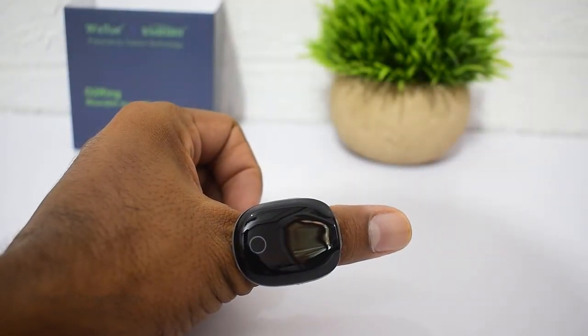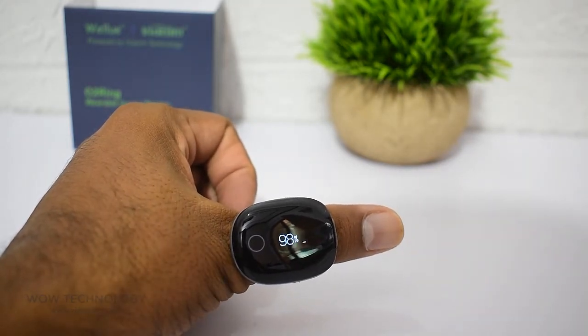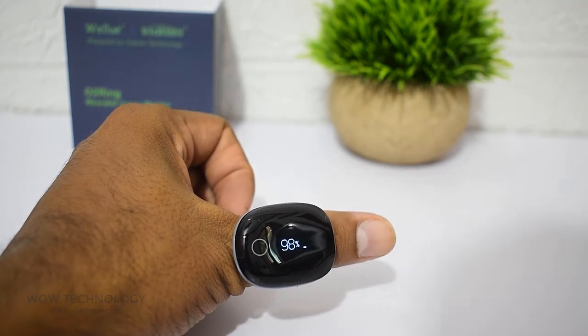The display is simple, pleasing and informative, but only shows a limited amount of information: your real-time heart rate, SpO2, battery level, and the time. All other metrics are only available in the app.